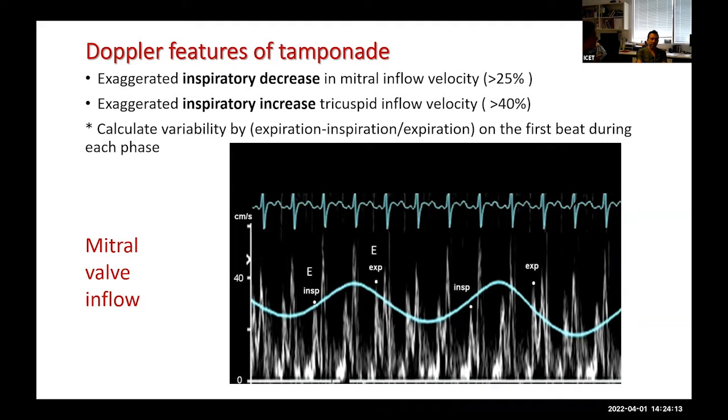And that's for the mitral, that will be stemming from that interventricular dependence, right? Yes. The septum moving over. Yeah. Well, not exactly, actually, but it's near enough.